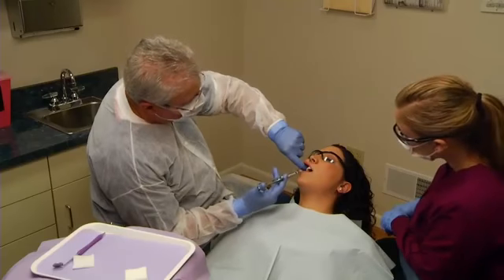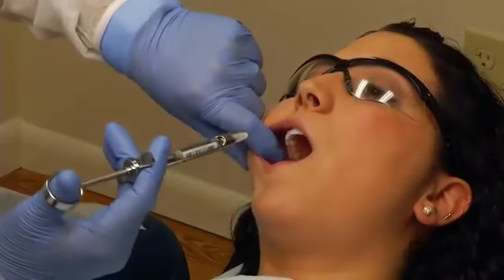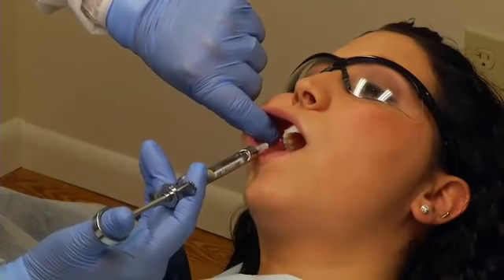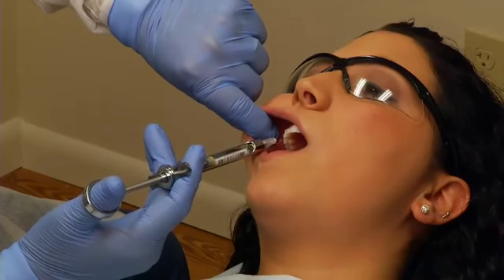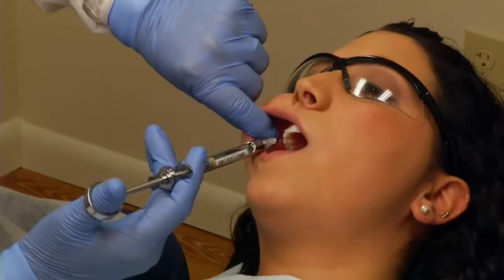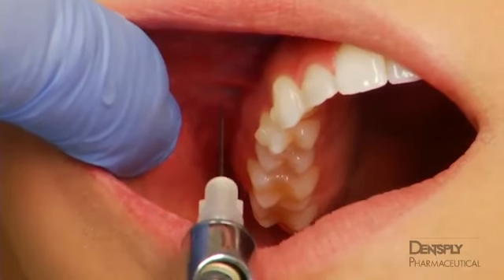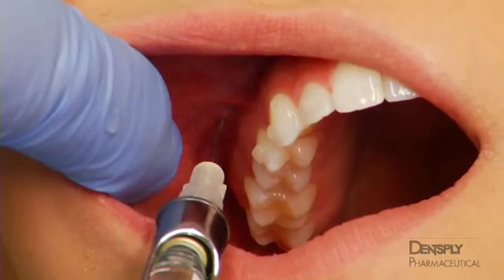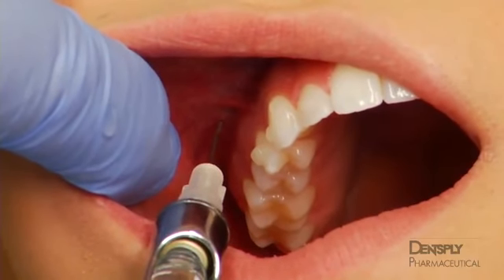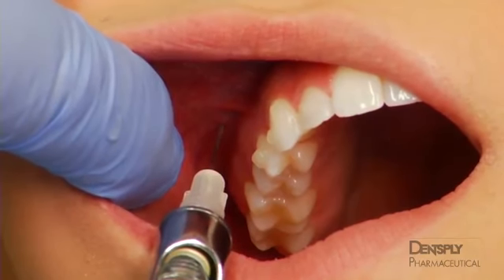Using a 27-gauge short needle, orient the syringe parallel to the long axis of the tooth with the large window facing the operator. Insert the needle at the height of the mucobuccal fold at the apex of the maxillary second premolar, approximately 1/4 of the depth of the short needle, about 5 millimeters, or until the bevel is slightly superior to the apex of the tooth. Aspirate within 2 planes. Slowly deposit 0.9 to 1.2 milliliters of solution, about 1/2 to 2/3 of cartridge, over 60 to 90 seconds.